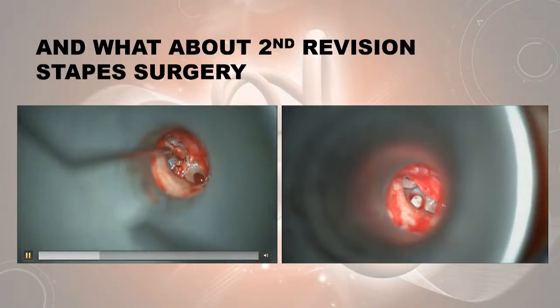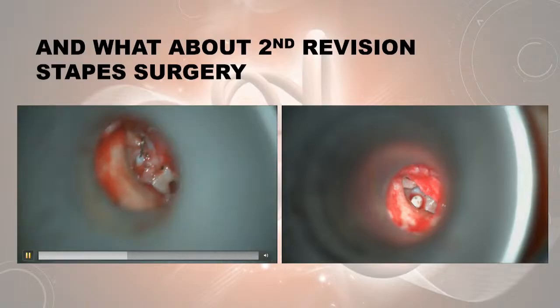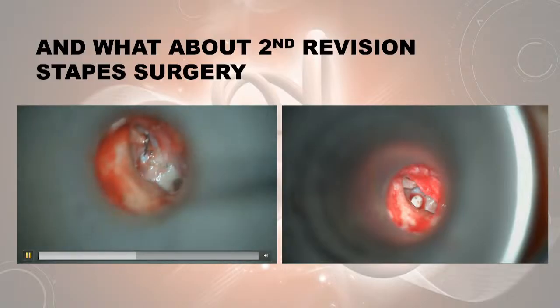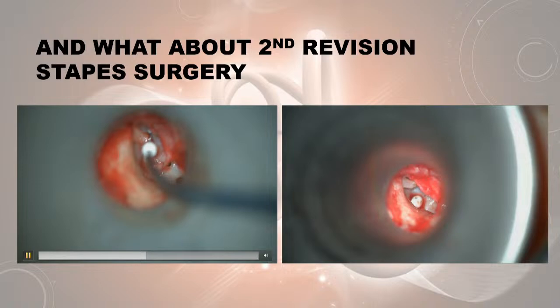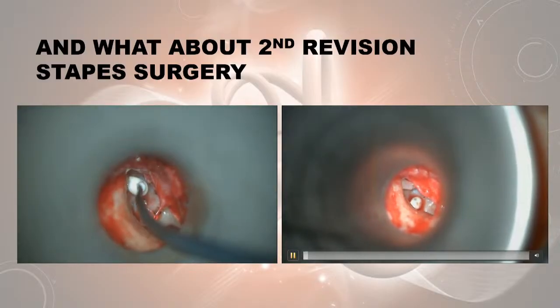That's what we found. An eroded tip of incus that we basically removed, and now we had to replace the piston. But at that stage, I thought this should be fine for a little bit of cement. So I put a little cement on there, was happy, had a lovely result, and was very chuffed with myself. It didn't even last 2 years, 2.5 years exact. I had to go back. We'll look on the right-hand side now, and that's what I found.